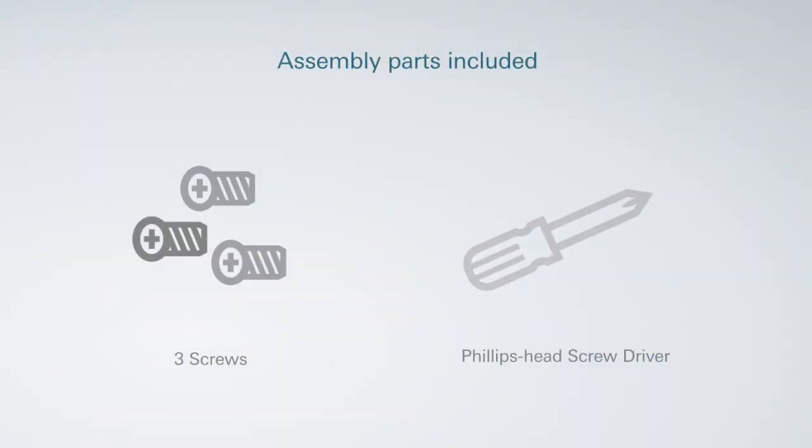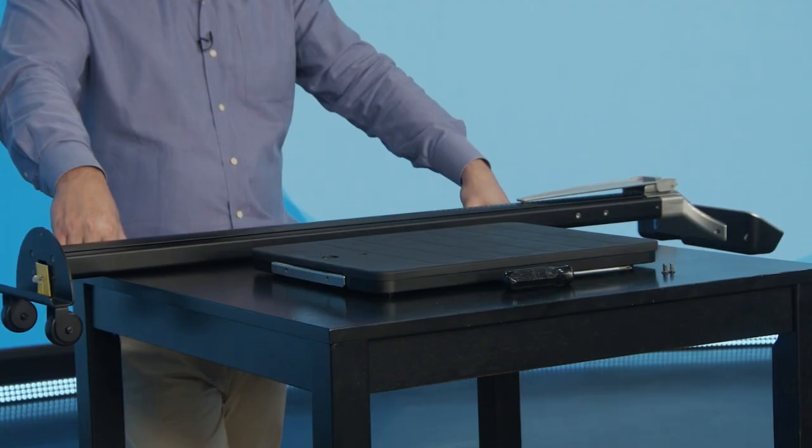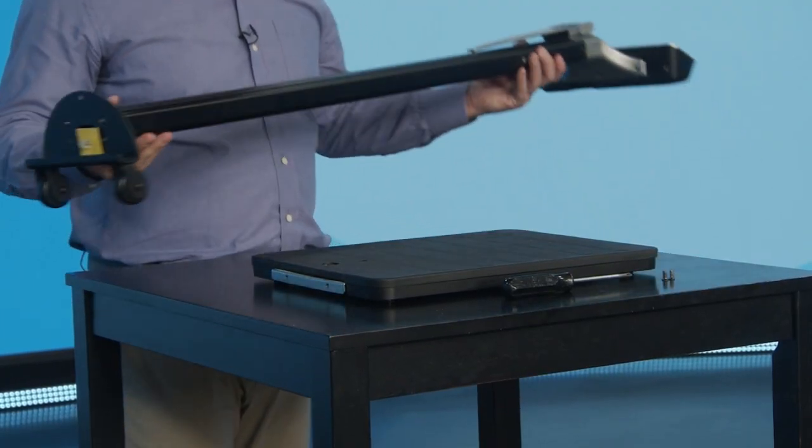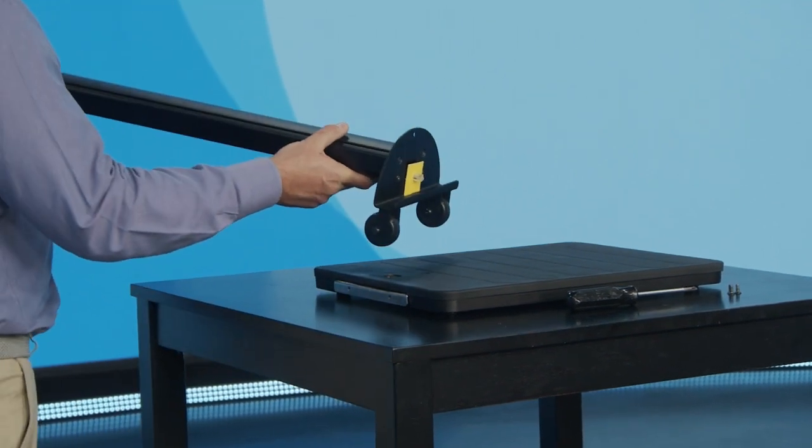Scales with columns will require some assembly. Remove the scale from the packaging and set aside all parts. Find the bag containing 3 screws and a Phillips head screwdriver. Remove all items from this package and set near the scale platform. Place the platform right side up and pick up the column.